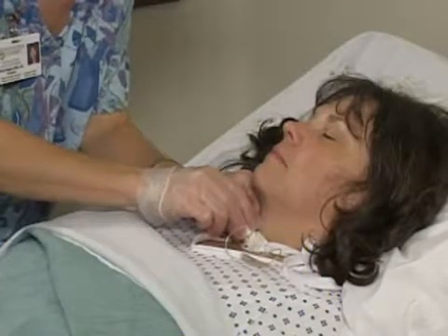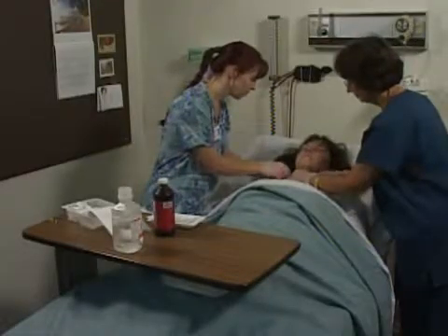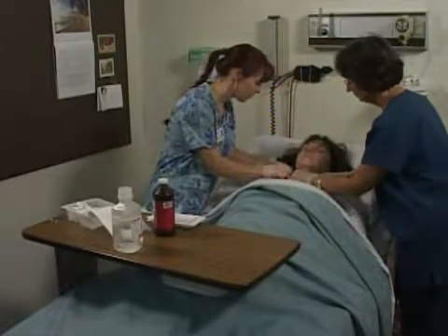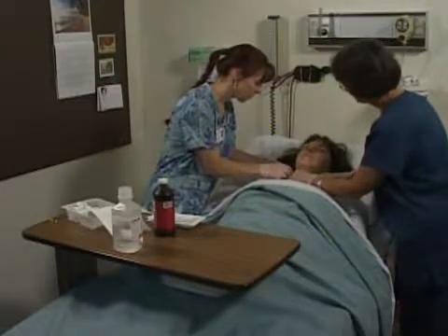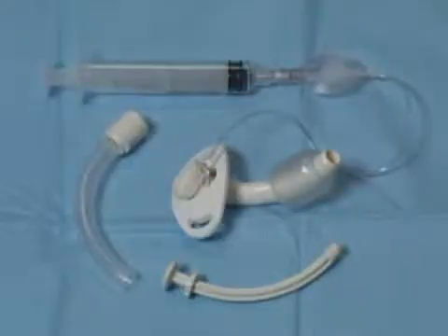You will not have cleaned the outer cannula at all. It is preferred that a second person be available to assist with changing the ties on the tracheostomy, only because there should be no opportunity for it to be dislodged. An obturator is kept at the head of the bed to place in the tracheostomy opening in the event the outer cannula of the tracheostomy tube comes out. As this is an emergency situation, it should be avoided by having the second person with you for the brief time it takes to change the ties.